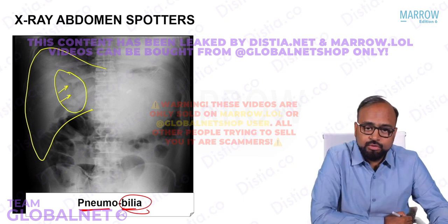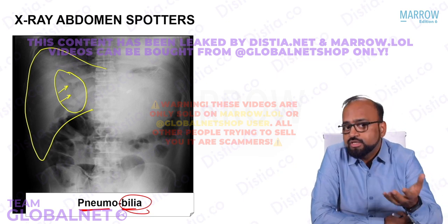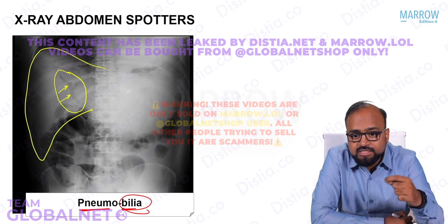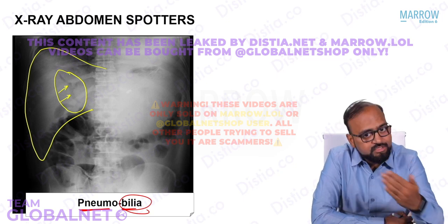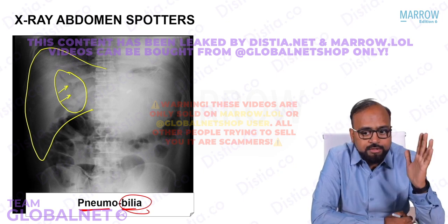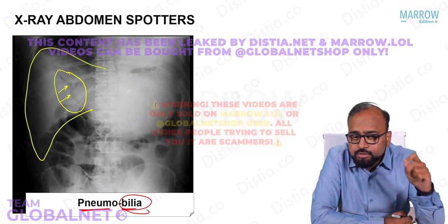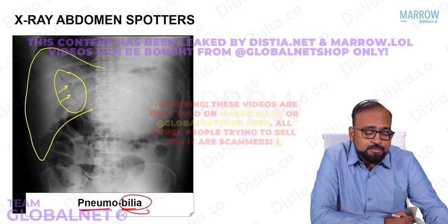So air has entered into the biliary tree. The most common cause of pneumobilia is recent instrumentation of the biliary tree. Say an ERCP has been done, a stent has been put, or say a biliary enteric anastomosis has been done. So air enters into the biliary tree. But remember, there is a specific cause of pneumobilia, and that is related to intestinal obstruction in a way.